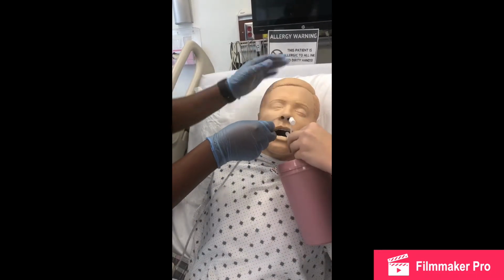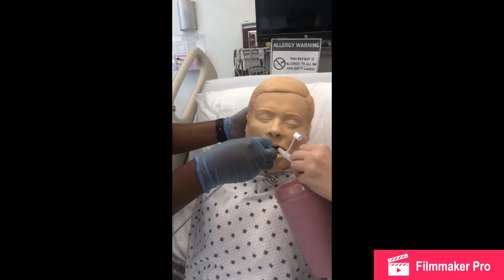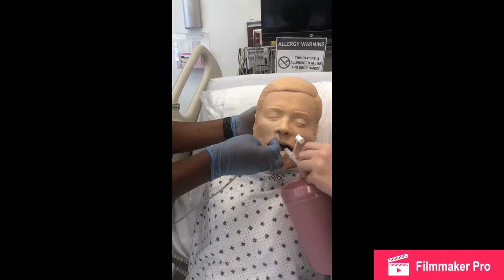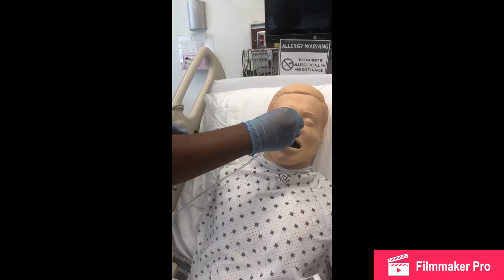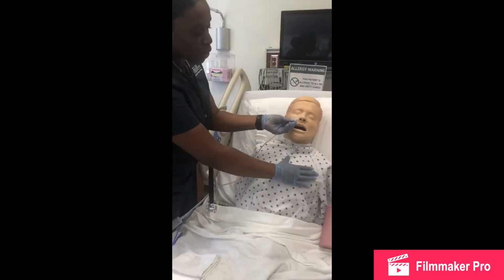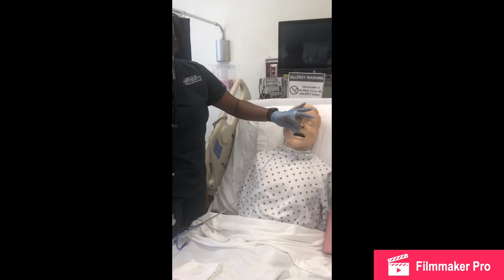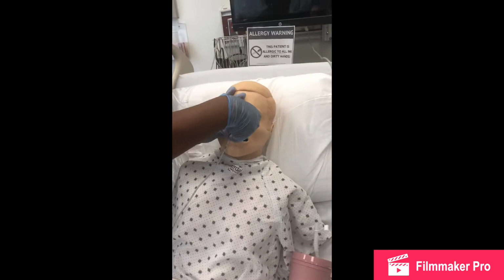Taking careful sips. Extend the head forward while I carefully walk my fingers. Place the tube in. At this point, in a real life setting, the patient may be coughing or anything, and typically we'll have a towel over the chest to collect any secretions. After I've reached my mark, I would then start placing the tape on my patient.